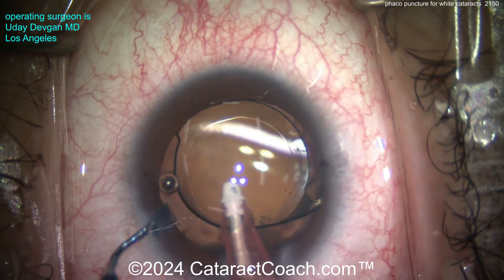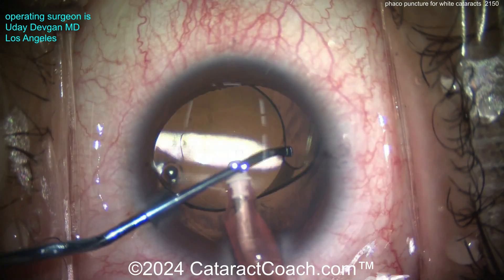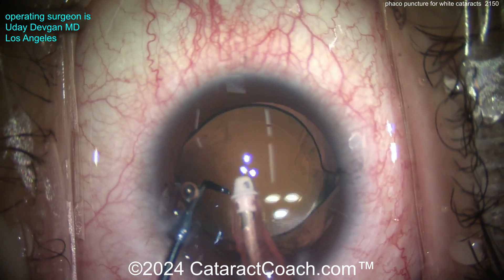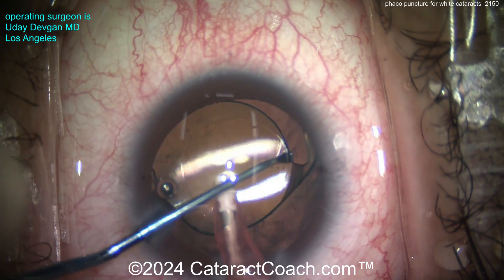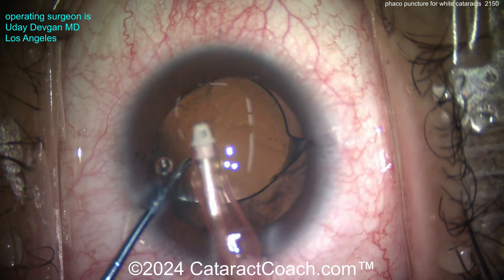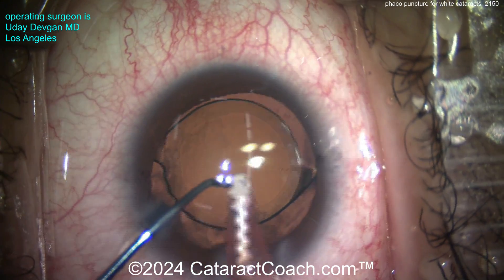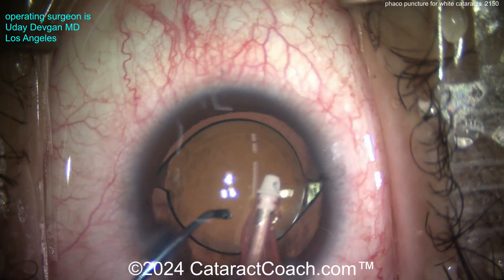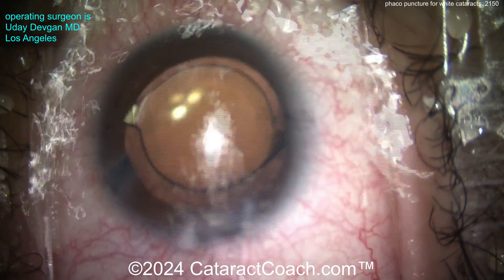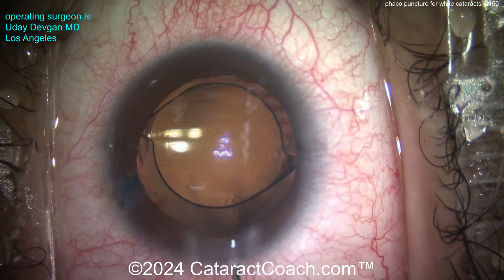Phacopuncture — a neat technique, something to consider. It can be done very easily. Remember: you need appropriate settings. Single burst mode, a very short burst of 20 milliseconds, low vacuum of 100 or 200 millimeters of mercury at the most, and low flow of 20 cc's per minute. Only the single burst. If you go in with too much energy or too much vacuum, you can go right through the lens material and hit the posterior capsule — that would be bad.